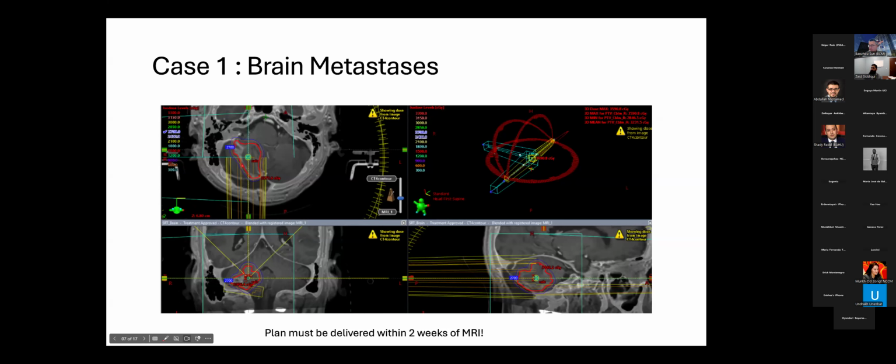So now the question, why use 3 fractions? For the longest time, we used to use single fraction radiosurgery doses. So this would also be treated in 1 fraction. That is still an acceptable alternative, and we'll look at what dose we can use if we treat in 1 fraction, especially if the patient is traveling from a long distance. Actually, when I worked at UPMC, we did have patients traveling 100 miles or more just to get their radiosurgery, and they were not able to stay in the cancer center area. So we still treated with 1 fraction.